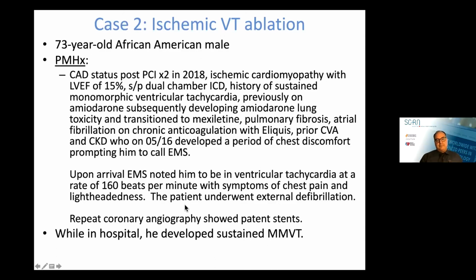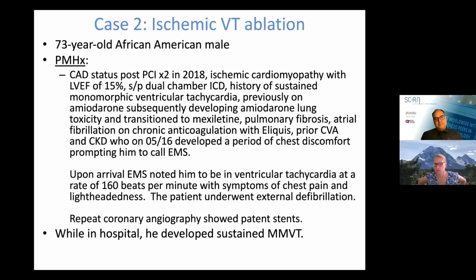Yeah, and I want you to make another statement on how to program the device during the ablation. It doesn't really matter which device. Especially with your pacing trick, where you pace to capture the A before you ablate, what do you need to do to avoid having the reed switch activated at a given vector? I know from our experience that this is quite different depending on which company makes the device. So what's your solution there?